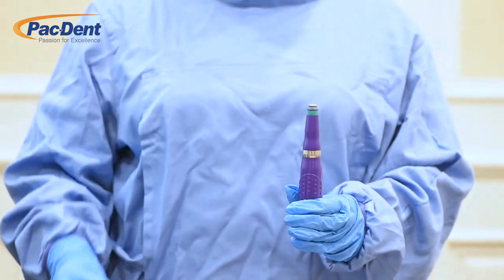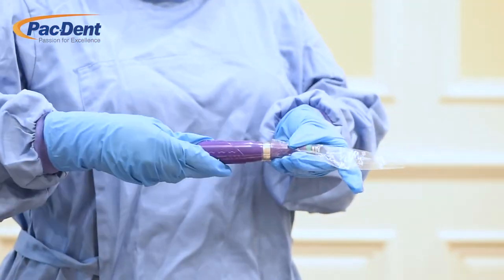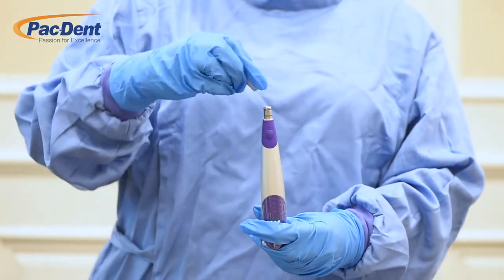To place a disposable barrier sleeve, remove the sheath from the handpiece. Place the disposable barrier sleeve over the handpiece and make sure it fits tight. Then replace the sheath back on the covered handpiece.